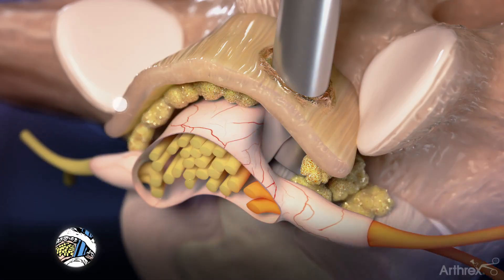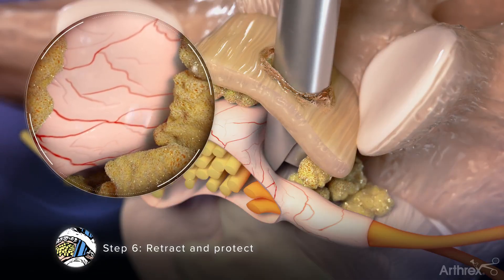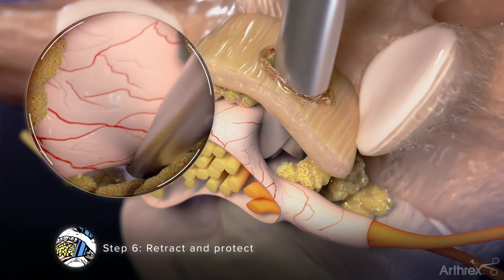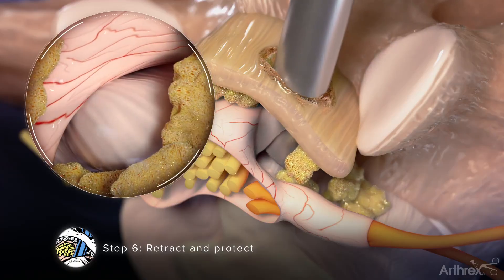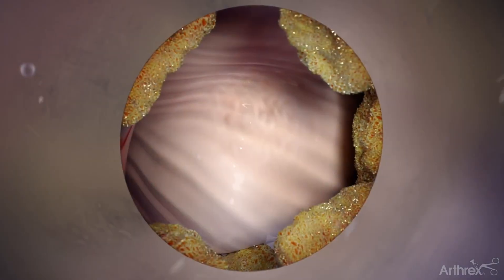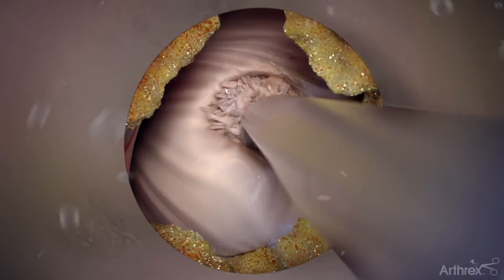Step 6: Retract and Protect. Mobilize the nerve root by using instruments such as a blunt tip elevator, nerve hook, and articulating probe to release any scar tissue that may be adhered to the dura. Once the nerve root has been mobilized, advance and rotate the cannula to retract and protect the nerve root. With the nerve root retracted and protected, use a blunt instrument such as an elevator to put pressure on the annulus, releasing the nucleus pulposus.